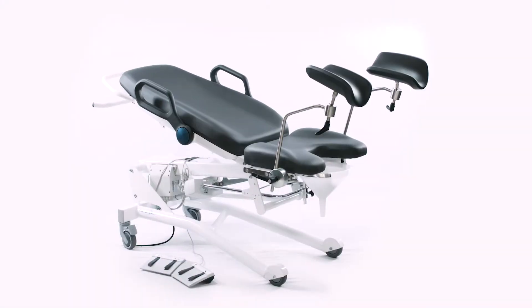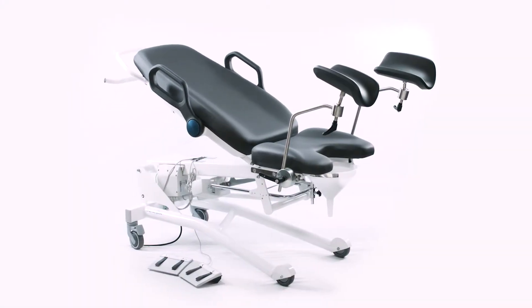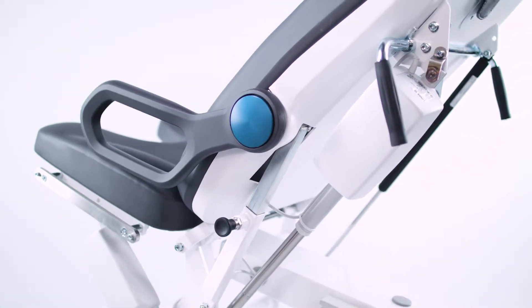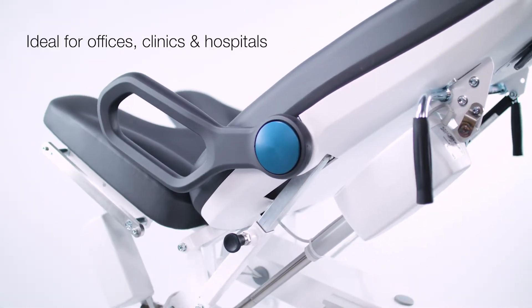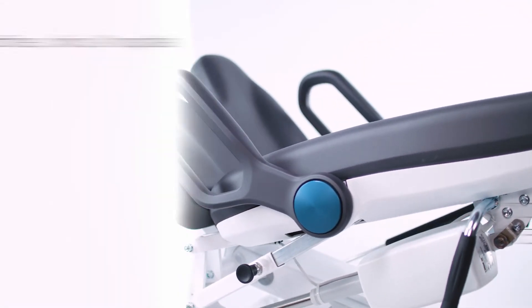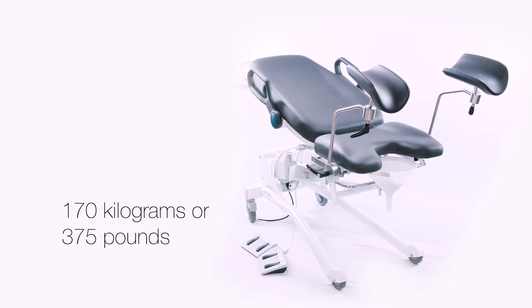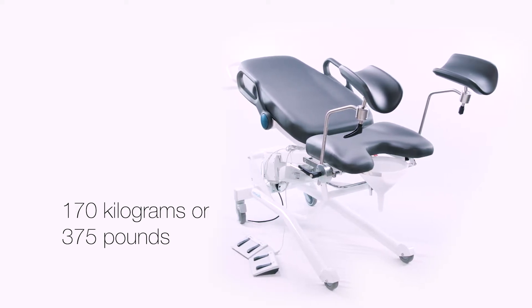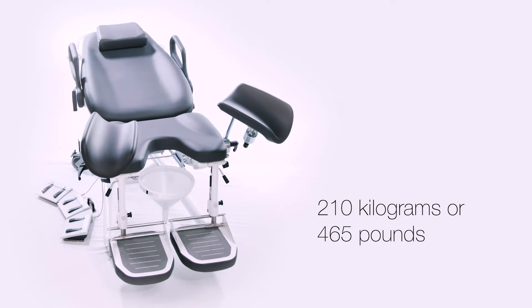The lightweight and ergonomic design offers unparalleled maneuverability. The chairs are engineered to be flexible, ideal for various practices including offices, clinics, and hospitals.